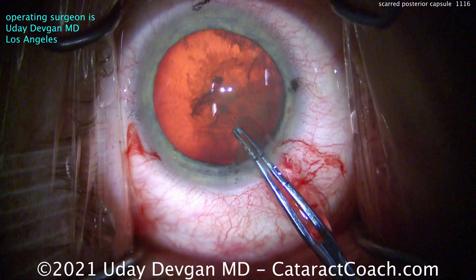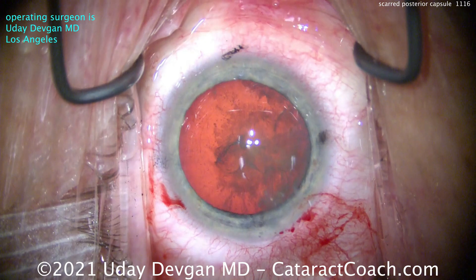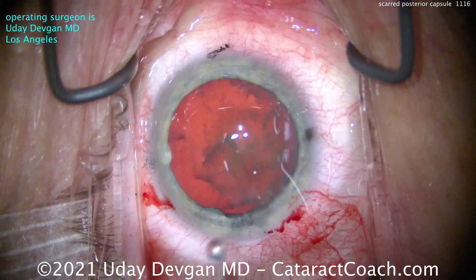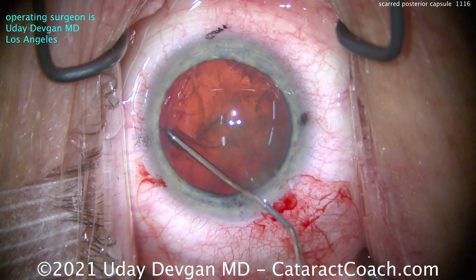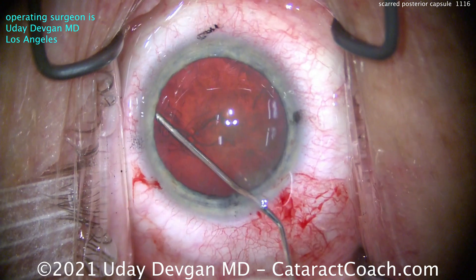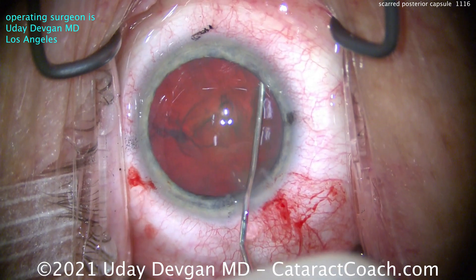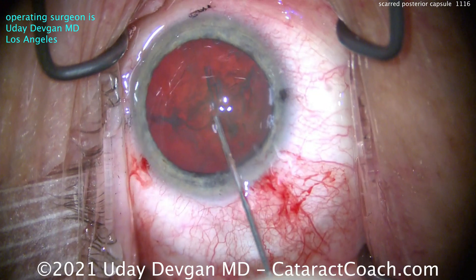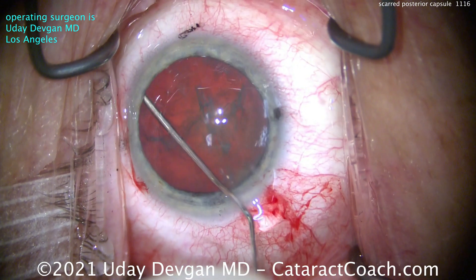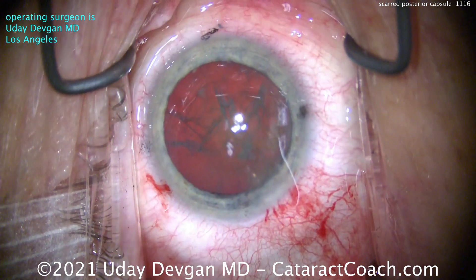This patient has had a posterior subcapsular cataract for a couple of years and really put off surgery for quite a while. As a result, it has a very dense PSC opacity, and there are certain spots we saw preoperatively that we thought would be tough to remove. I'm going to show you that intraoperatively and you can decide what we should do. There are a lot of options. The black marks on the cornea are just marks for the cardinal meridians.